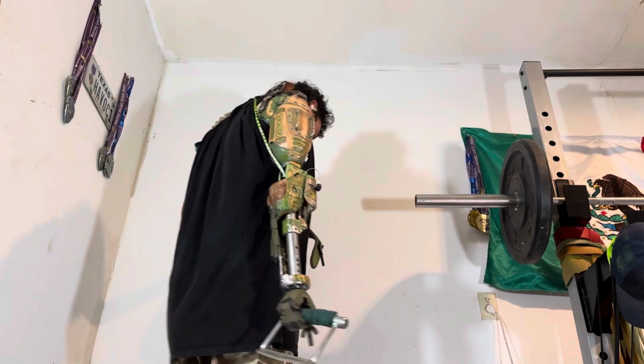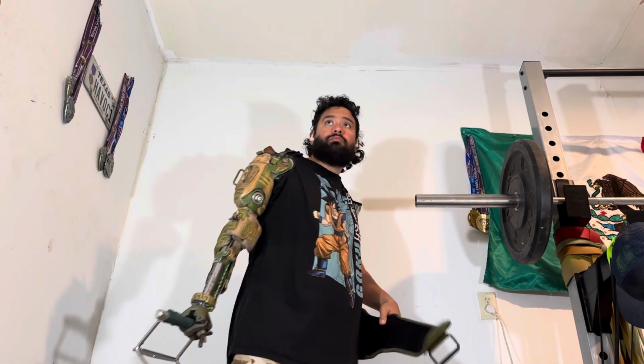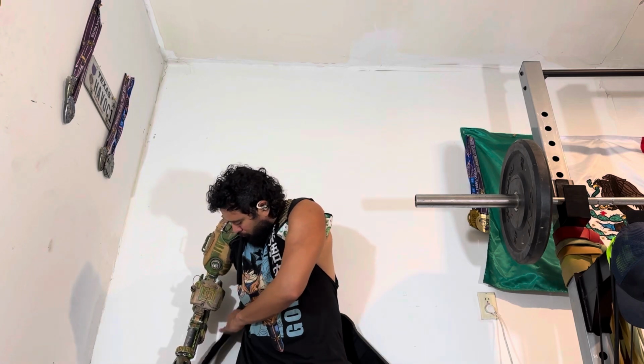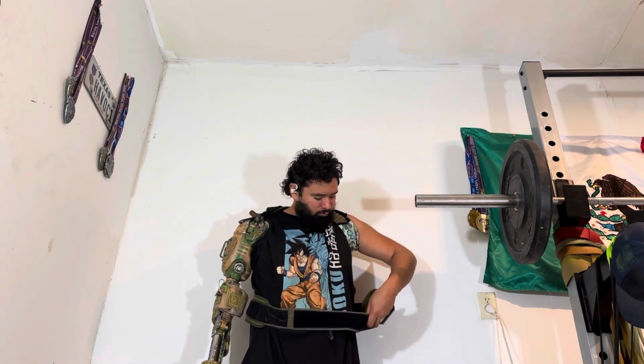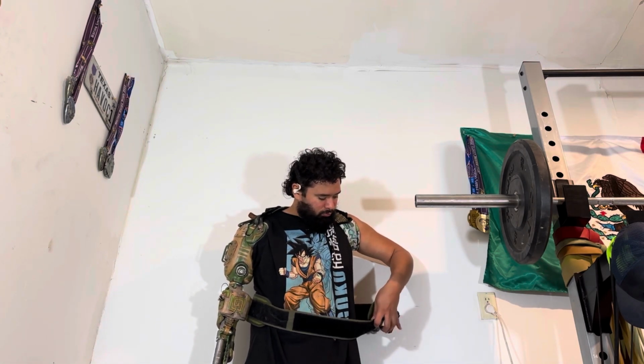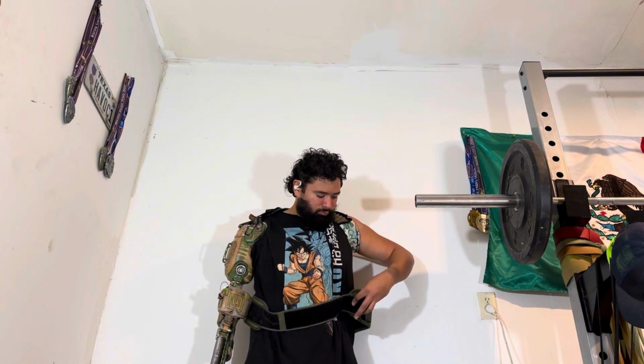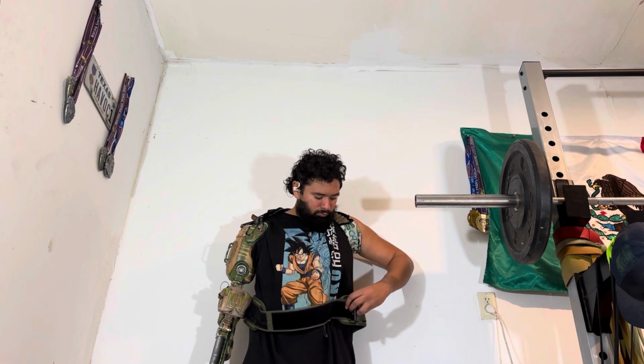But I have broken this specific arm just punching a tree. So, it's since been repaired. The wrist was what broke whenever I punched the tree. And so you don't see me do crazy weightlifting with it, just because of the nature of what the prosthetic's limits are. And so, I broke it punching the tree.